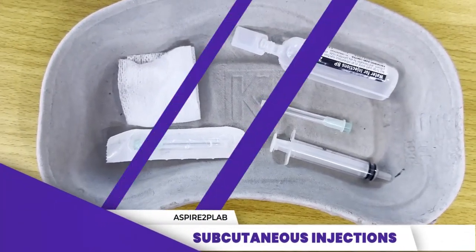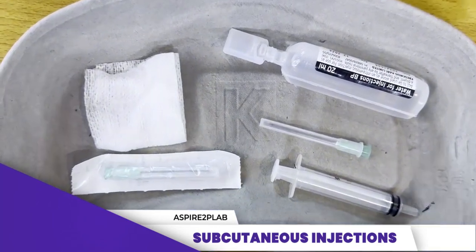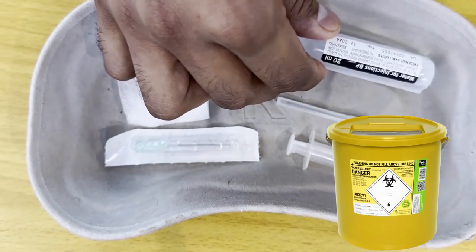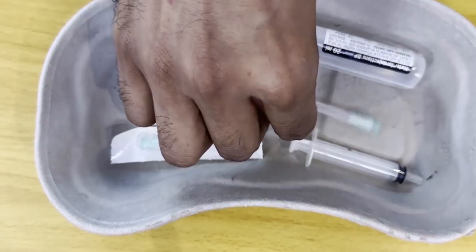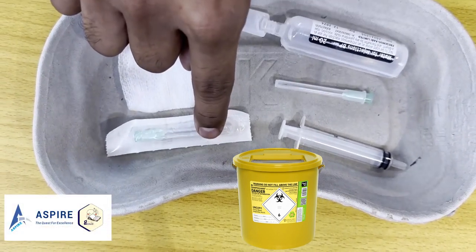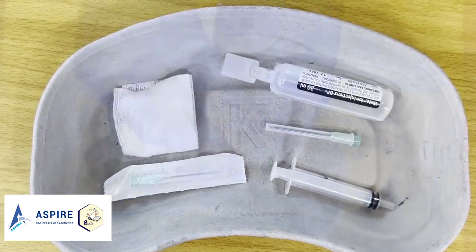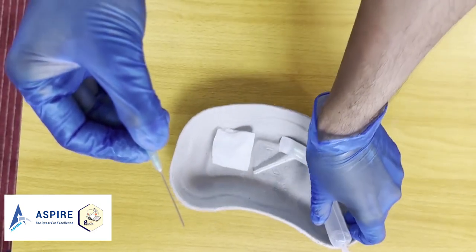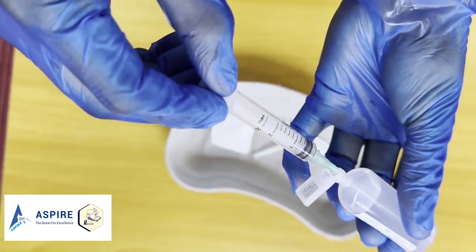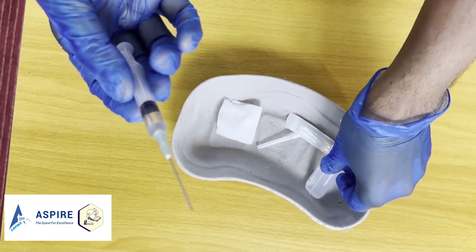For subcutaneous injections, make sure we are ready with our kidney tray. We need first of all the medication — confirm the type, dose, and route of medication, and definitely check the expiry date. We have the drawing-up needle, which is different from the injection needle, and we have the syringe and gauze piece as well. Now let's draw up the medication using the drawing-up needle.